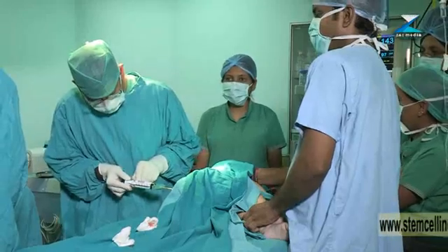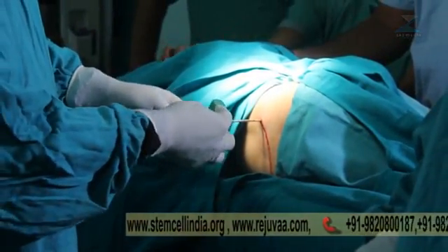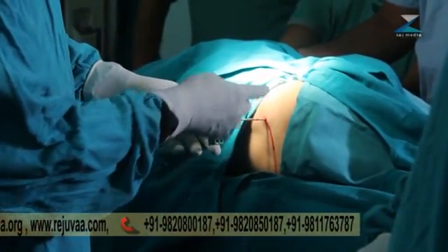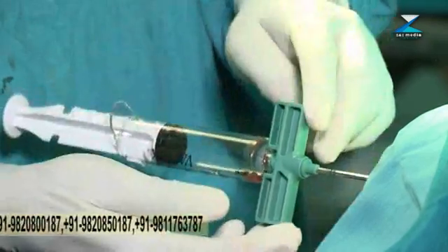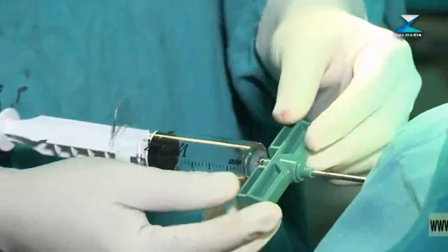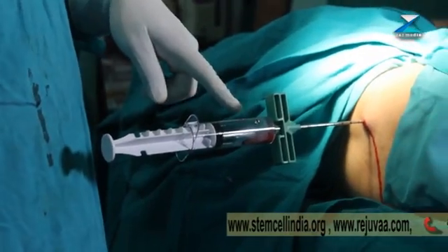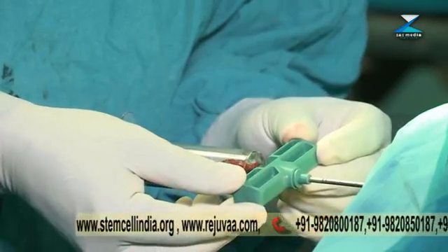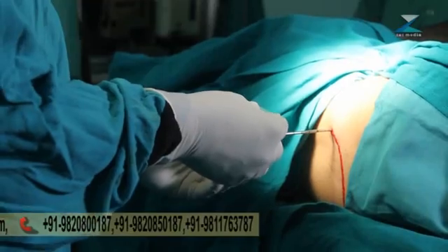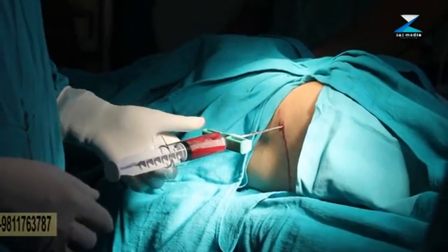This is a special syringe with a locking mechanism. You see, bone marrow has started coming out, although slowly. You see the bone marrow is being sucked out. We have to change its angle so that we get bone marrow from all directions. About 15 ml is already collected.